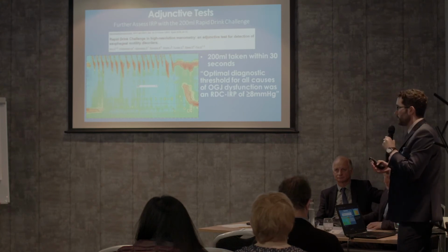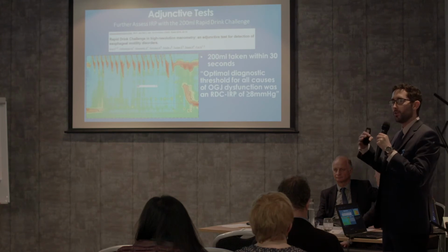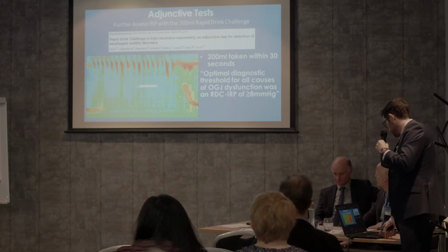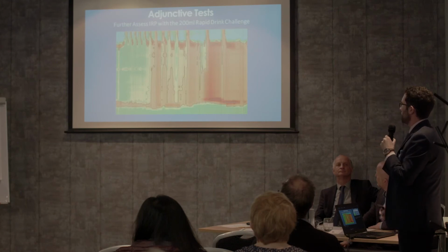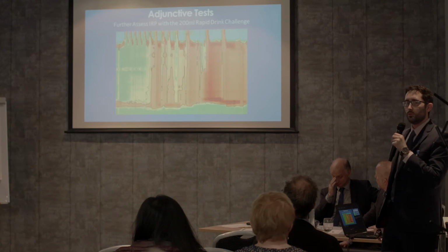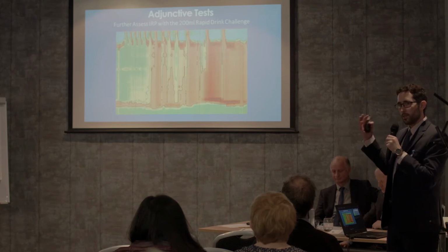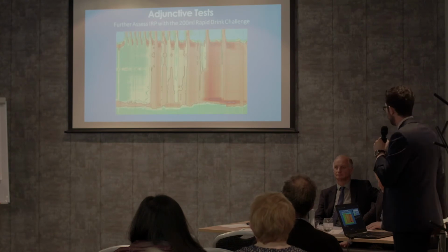A useful way to use this is if you're getting multiple interventions for the patients, or if they're being done by sort of progressive dilatations, you can then measure and compare in between the studies that you're doing. And just to give you an idea, this is a sort of a classic achalasia case where potentially it might not have been too obvious on the 5 ml swallows, but then this would give you the confidence. You can see no LOS relaxation, big pressurization in the esophagus, none of it's getting through, so just building up there.